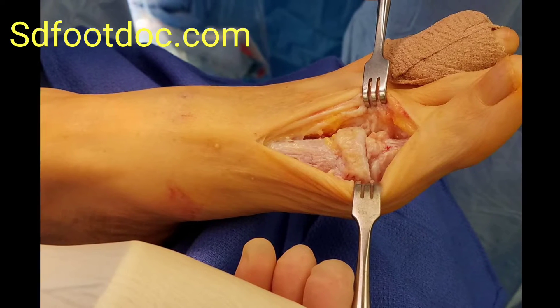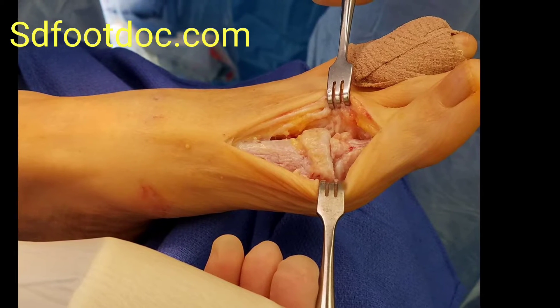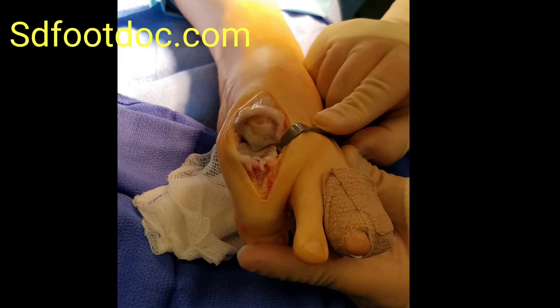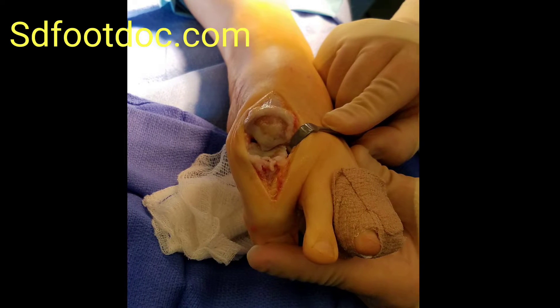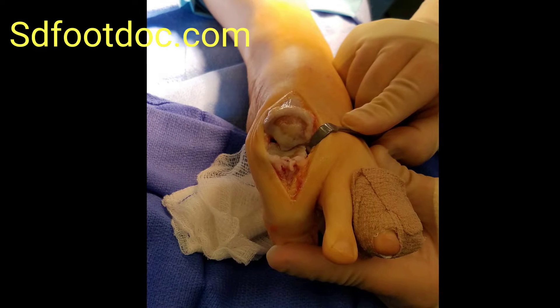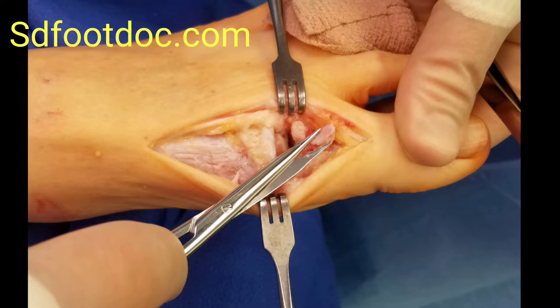Here in the surgery we remove the extra portion of bone that's growing on the top, called the spur. You can notice carefully how there's no cartilage left in the joint — it's all been mushed up to the top. Patients have had some small fracture portions of the joint as well.